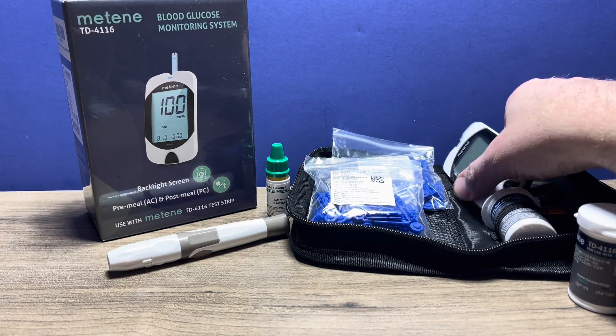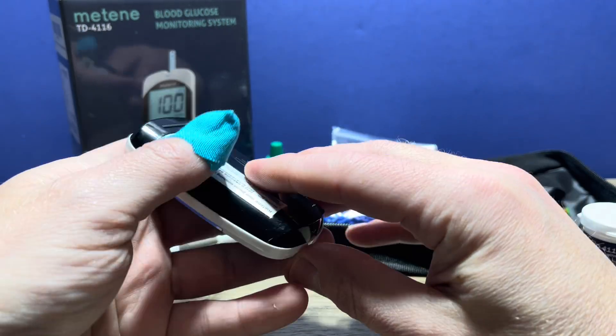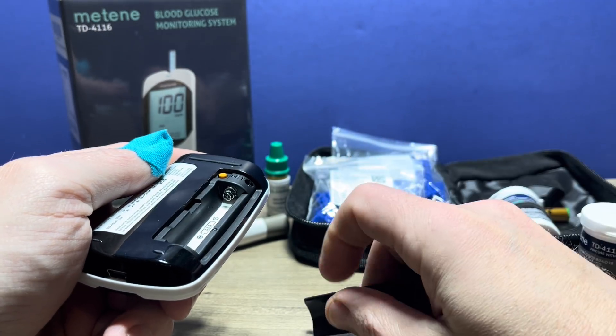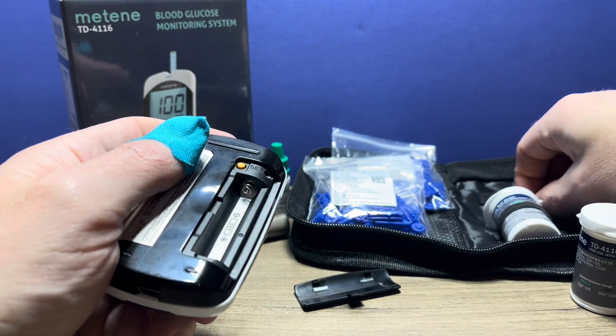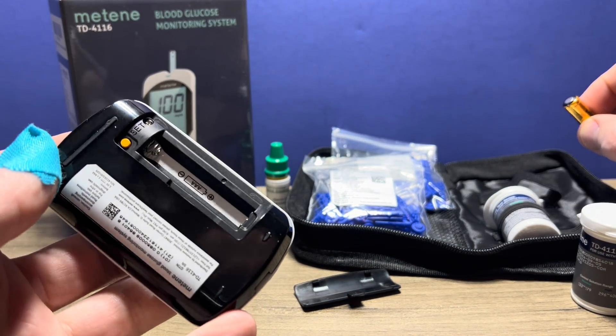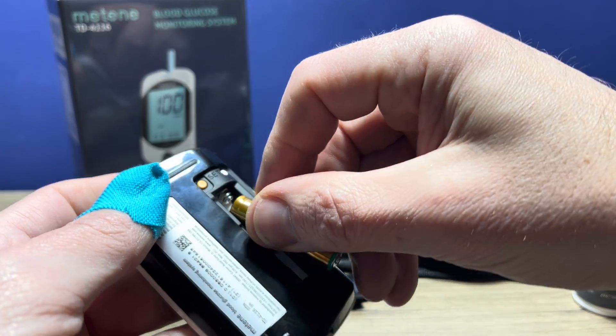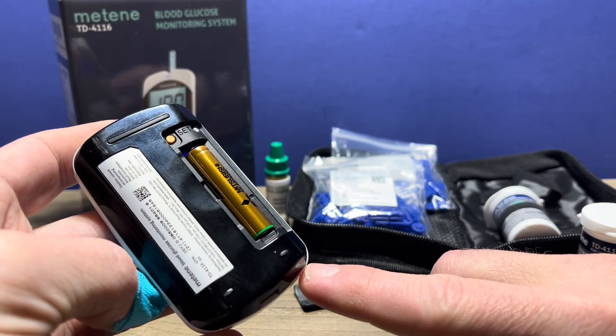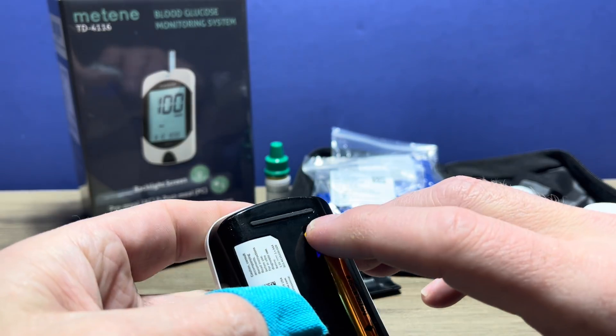But we're going to take a look at setting up the meter. First thing you'll want to do is insert the battery. The battery is accessed on the back there — remove that. It does take a triple-A battery, so you can go ahead and insert the battery. You want to leave the battery compartment open so you can access the set button.